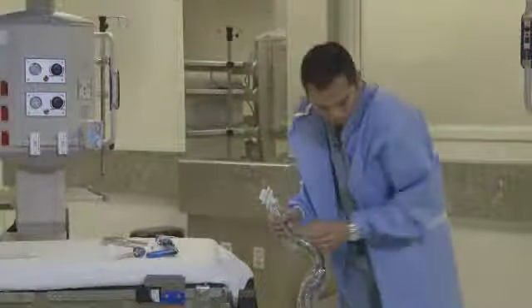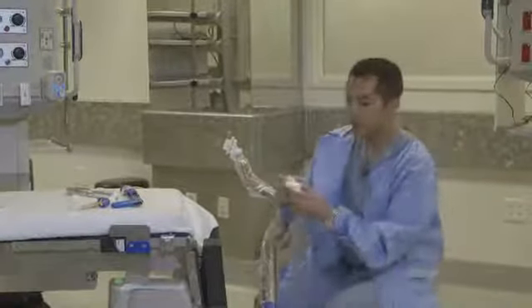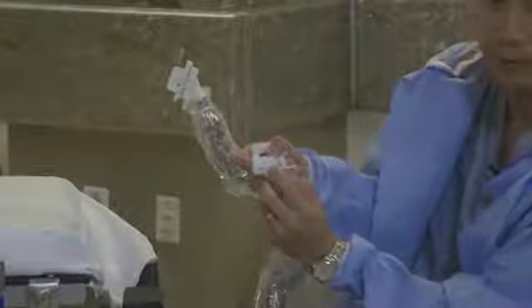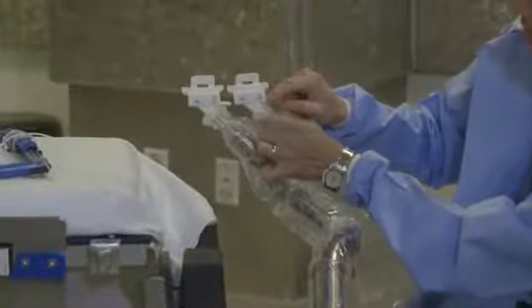Now, I'm going to show you how you can integrate the RUMI handle, right? So as I said before, I'm going to show you up close here. If you zoom in on this adapter, notice that now I've changed the orientation and the drawing is representing the RUMI handle. So if you can see that, that's going to impact how this is oriented with the patient. So I'm going to go ahead and turn this, and you can see now, by doing so, I'm going to adjust the handle so that it's facing in this orientation. And this is where you want to be if you're going to use a RUMI handle, right?